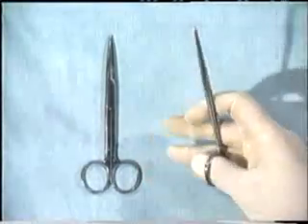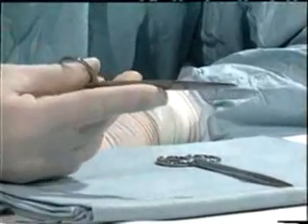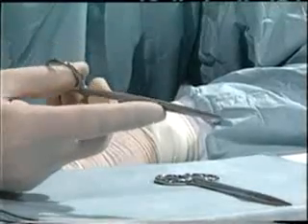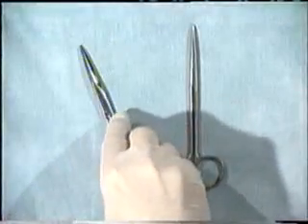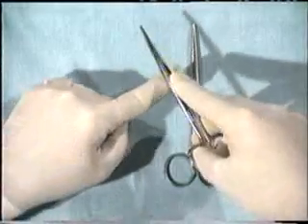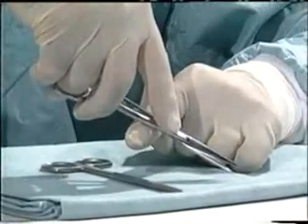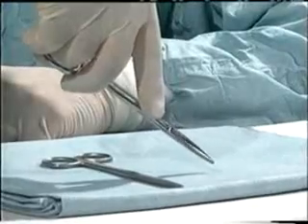Never put your fingers right the way through, as this makes it difficult to extract your fingers from the instrument. However, by using just the distal phalanges, you get very good control for accurate dissection. If you're cutting sutures at depth, such as in the pelvis, it's often wise to stabilize the instrument over your index finger. This allows for accurate cutting and prevents a tremor down a deep, dark hole.